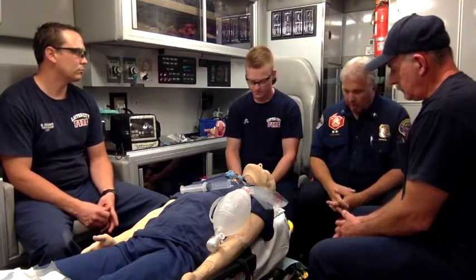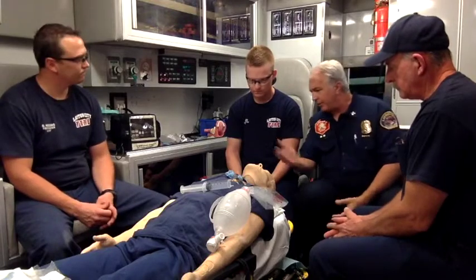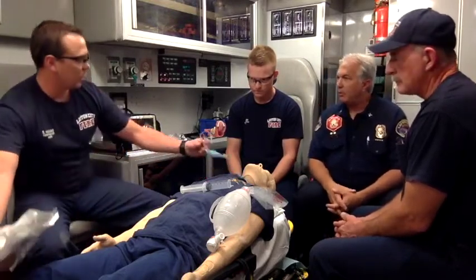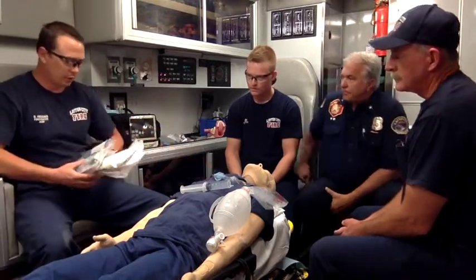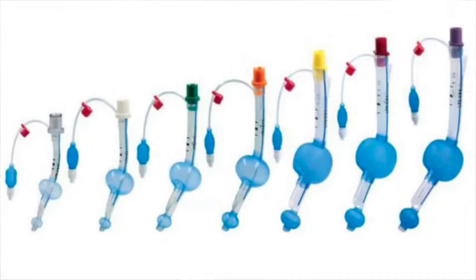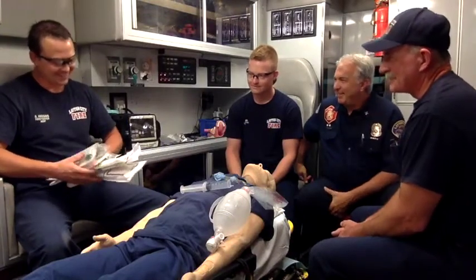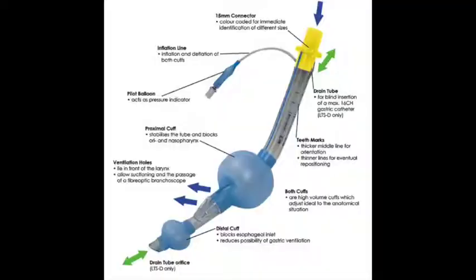So, Bud, what size you got there? We got a 4. Is that because that was the one that was out in training? Yeah, this is a 4. This one was open. We carry various sizes: 5, 4, 3, 2 and a half, and a 2. And sizing these, I guess we can move on to that.